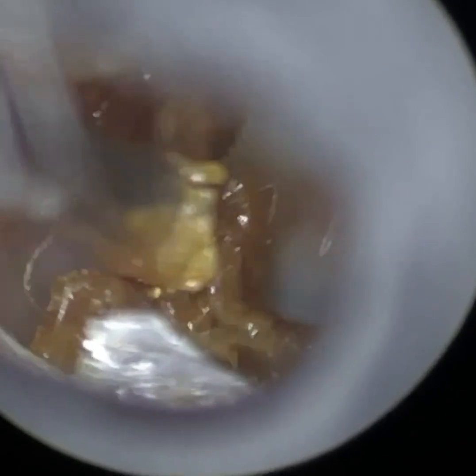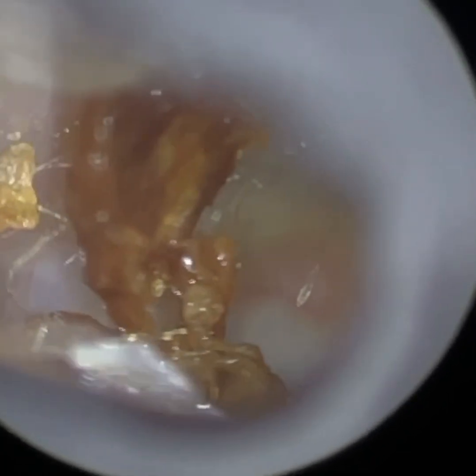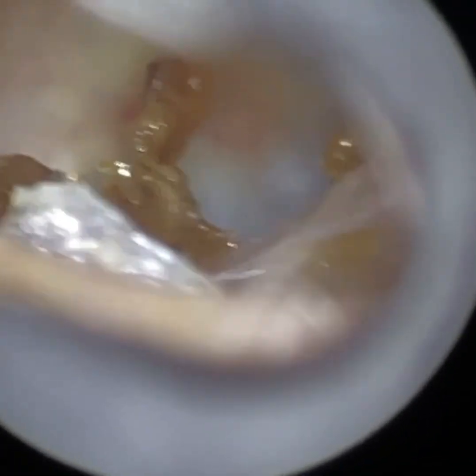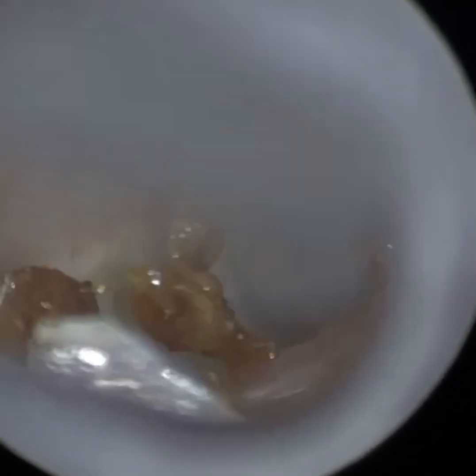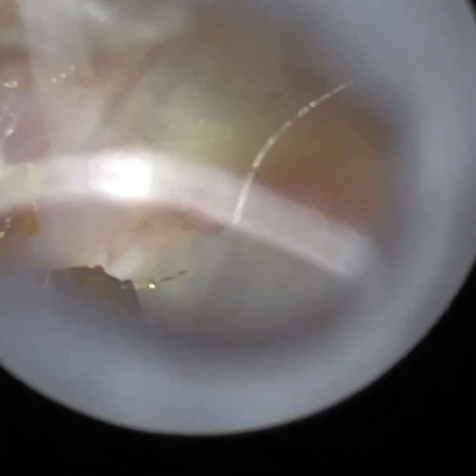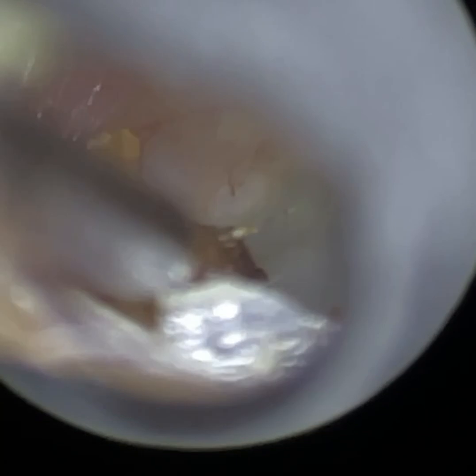You can see the fine end — it's a lot thinner and it's all in focus. I noticed with some other technologies I was trialling that when the suction probe goes in, it was all dark and black in appearance, covering half the screen. It looked distorted — the suction did not look like a suction probe, it was like a zigzag. That was a reason why I really pushed the development of the Waxscope in the last year or so. I definitely feel there needs to be a really good alternative to the endoscope, and I think here we are.